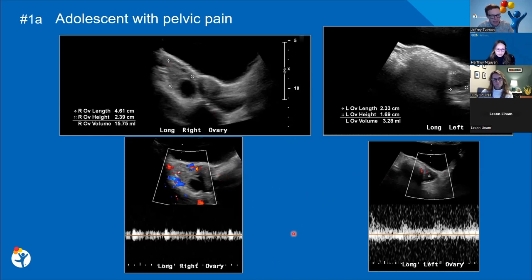Yeah, and I think that's definitely a great idea about the LMP. I have noticed our techs do that more frequently on outpatients, when they're wanting to measure the endometrial stripe for abnormal bleeding or something like that. I feel like we do it more commonly on outpatients, but that's definitely a good idea to do it more frequently on all these patients. Yeah, because aside from the LMP, as the technologist is scanning, in the front portion of it, they can just type in vomiting or pain X days. Right, because we usually give that minor history.